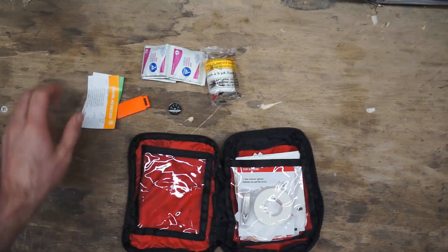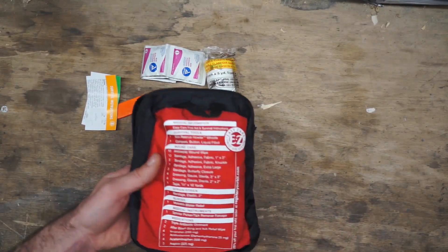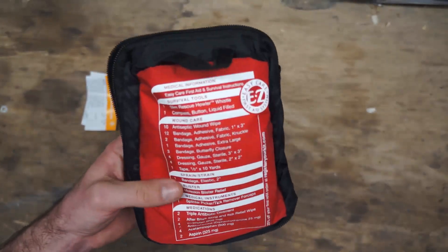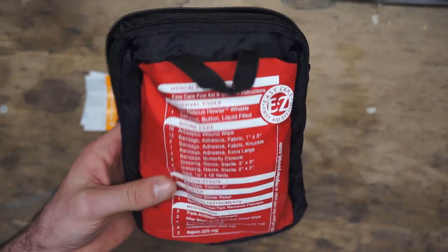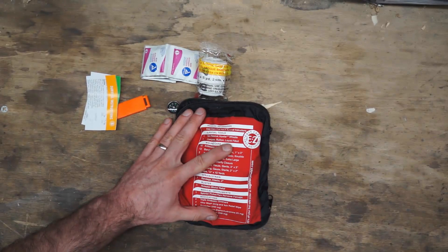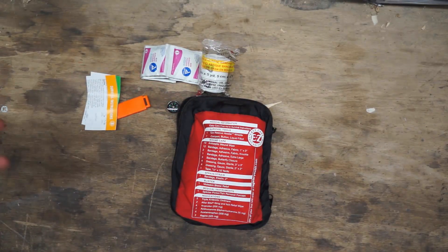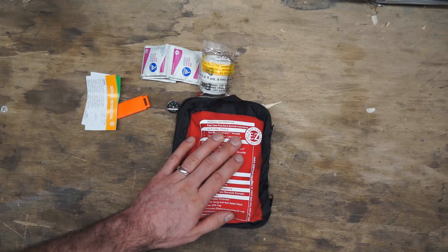That's all that's in here. It's a fairly minimalist kit, ready for one to two people. It's good in terms of quantity for minor cuts, scrapes, bumps, and bruises, but that's really about all it's good for. If you're looking for more advanced care for traumatic bleeding or broken bones, this is not the kit for you — you really need something much more comprehensive.